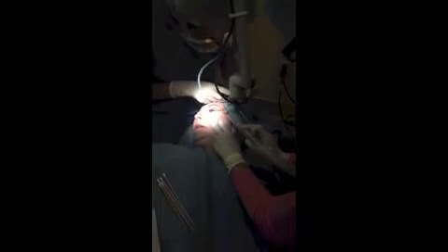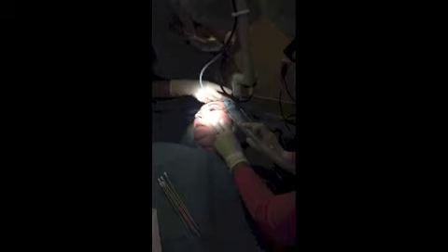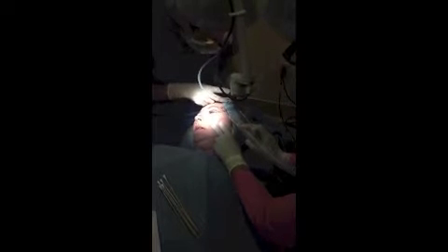Ouch. Hang tight. A couple pulses, just a couple pulses out here. Good job. That's the worst you're going to feel. That's when we get out to the sides there. That wasn't as bad as my feet.